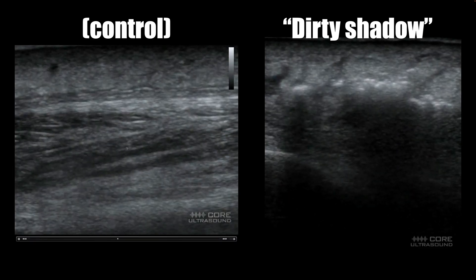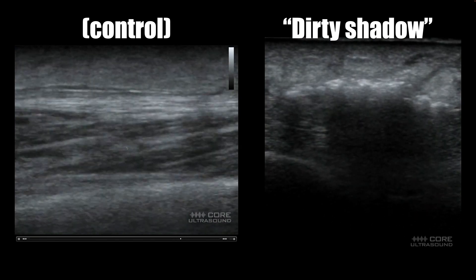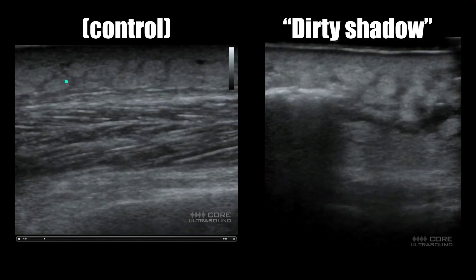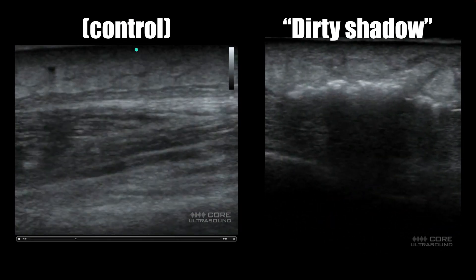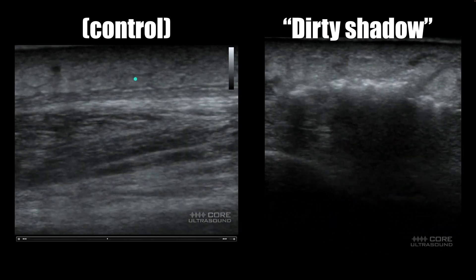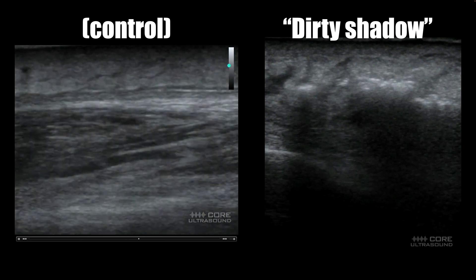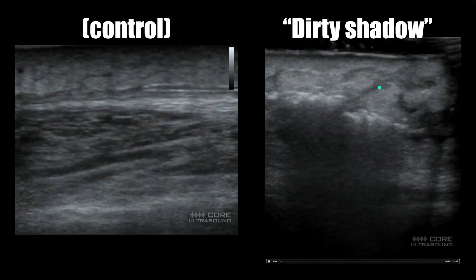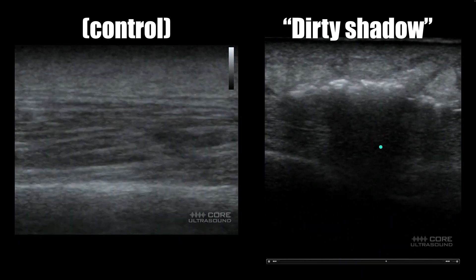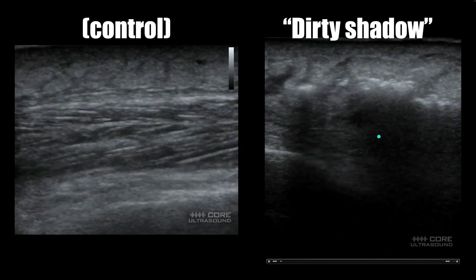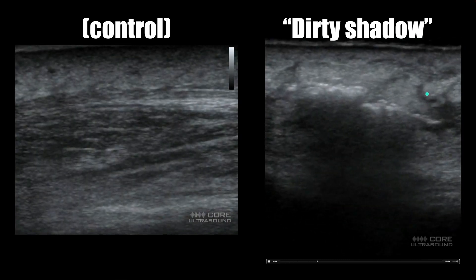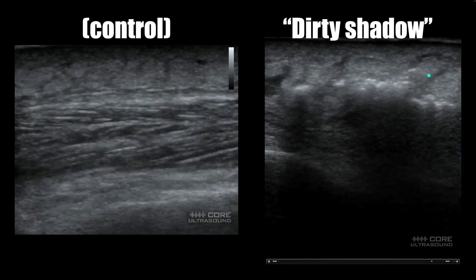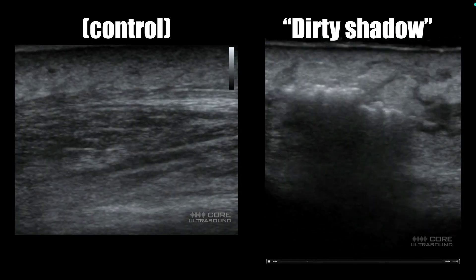Here is a clinical scenario in which identifying the dirty shadow is important. We have some soft tissue with a little bit of edema through it, and over here we're seeing little hyperechoic flecks with gray shadowing deep to them. This is a necrotizing soft tissue infection.